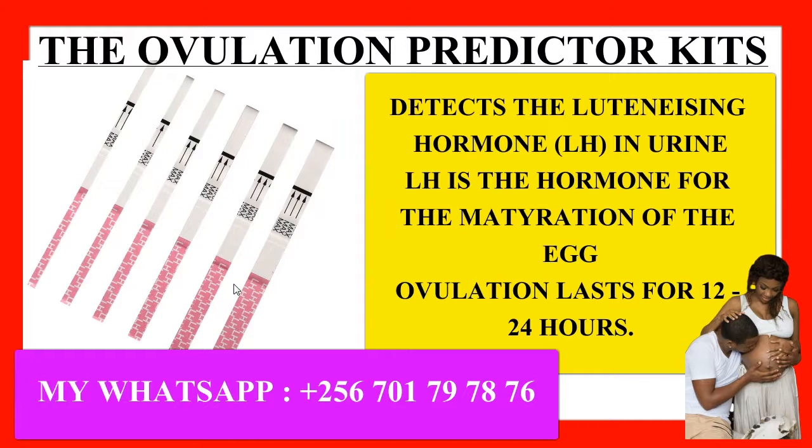So these kits, the ovulation predictor kits, as the name suggests, are testing strips designed specifically to predict when you are about to go into ovulation. There are many types on the market, but the most common ones are the testing kits. There are also more expensive ones, for example the Rapid Response and the Clearblue types, but the testing kits type of predictor kits are really widely available.